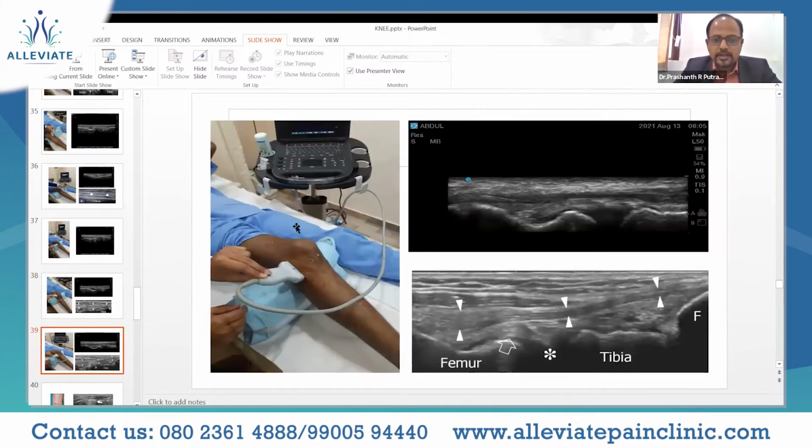Then we have to evaluate one more structure which is present laterally, that is the lateral collateral ligament, which extends from the lateral femoral condyle onto the fibular head. So two bony prominences have to be seen along with the band-like structure. That is exactly what we are seeing over here. This is the lateral femoral condyle, and then the fibular head, and this is the LCL, which is seen in this image as well. As you can see, it is angled. You can also palpate the head of the fibula and then try to adjust your probe as well.